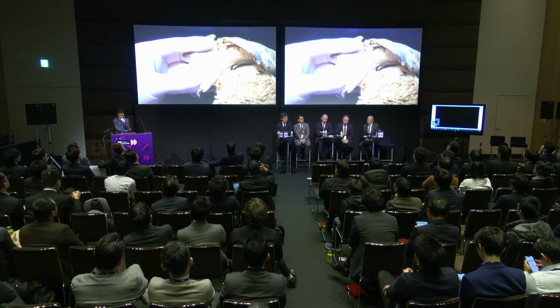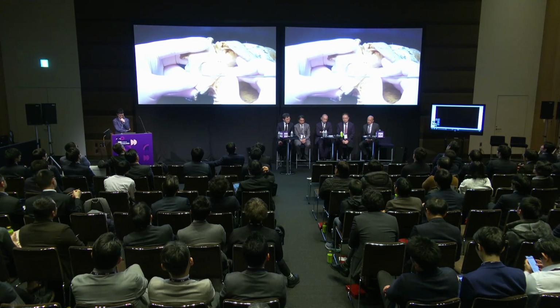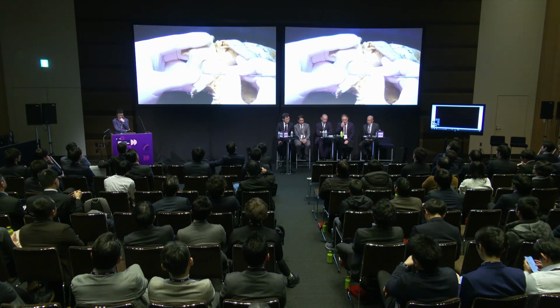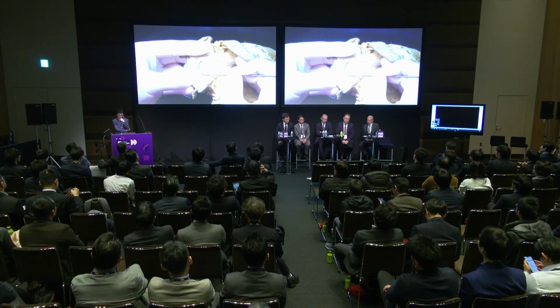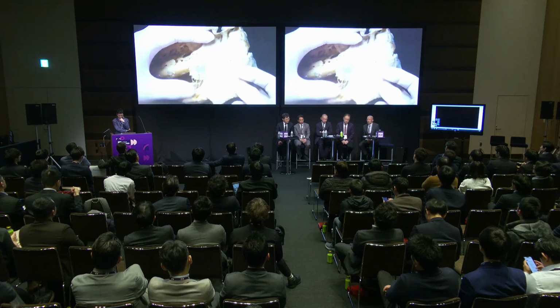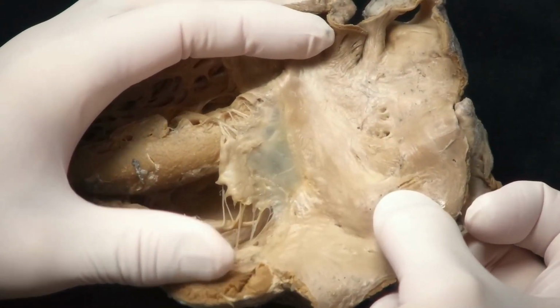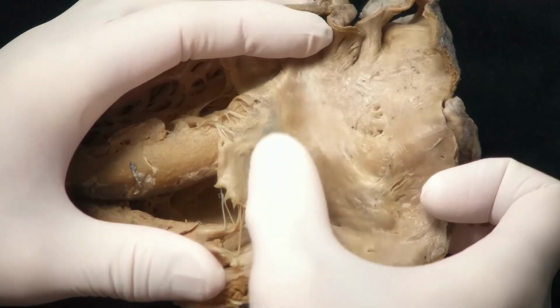Well, of course, one requires a posterior puncture in the atrial septum, and the other, ideally, a more posterior inferior one, and that's because of the different orientations of the structures on the left side. So if we turn this sample over and I show you the relative positions from the left aspect, if we look from the other side, then here is the region of the atrial septum. My finger is in the oval fossa. So a posterior puncture allows you to steer the sheath into the mitral valve, so you approach the mitral valve in the correct fashion.